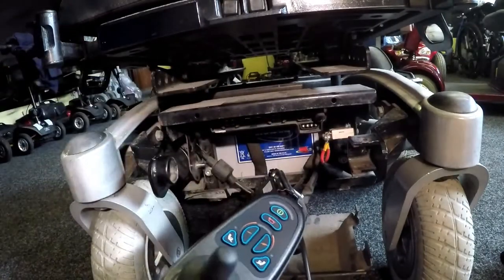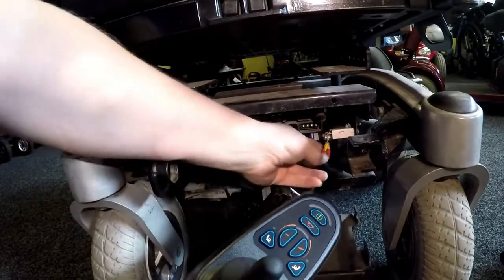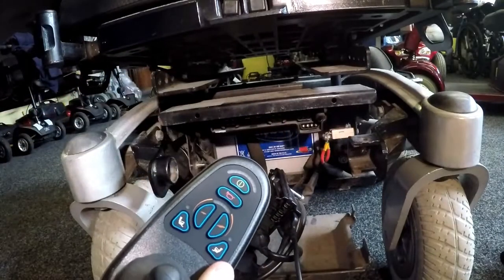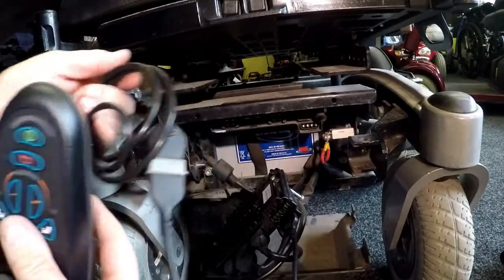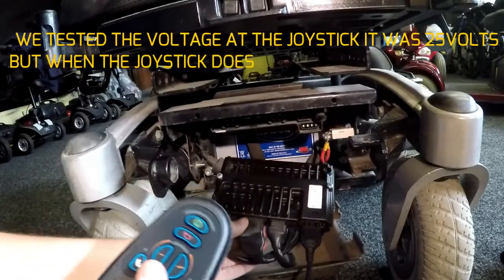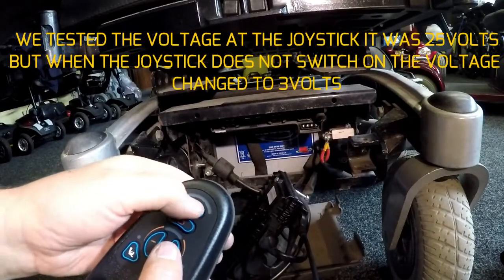It's not switched on either. There is a different problem, not the power module whatsoever. Why is the power module not switching on? Why is the brand new joystick not switching on? There's only so many electrics on. You've got the cable, which is brand new. We put a new extension cable, which is brand new. Power module, which I know is working, and it still won't switch on.